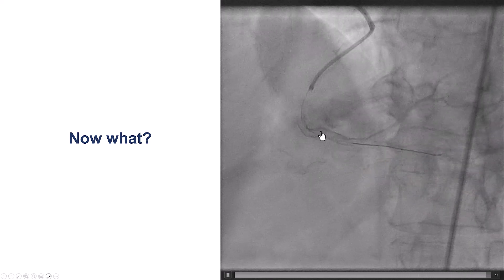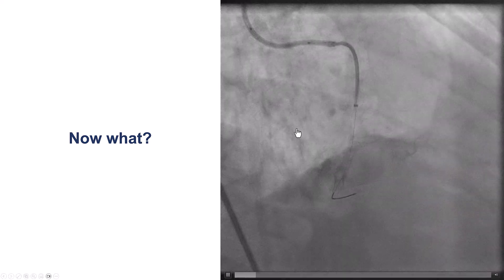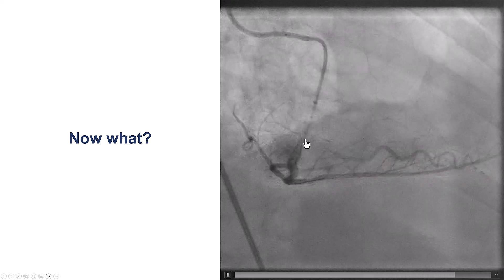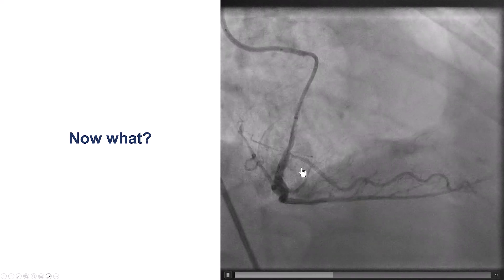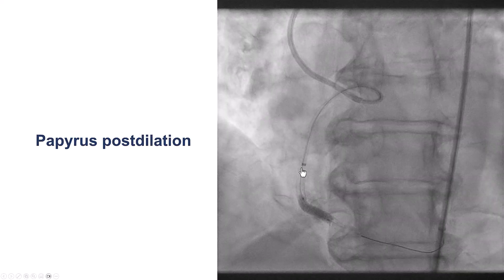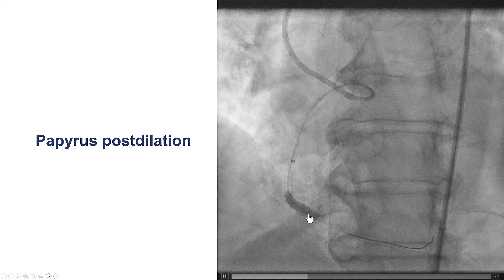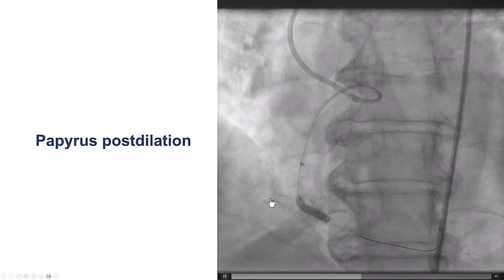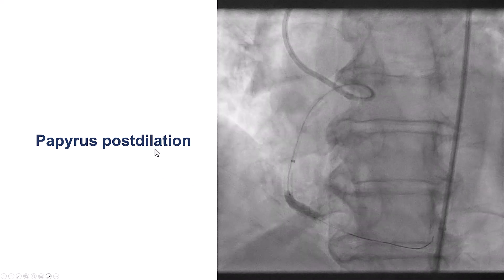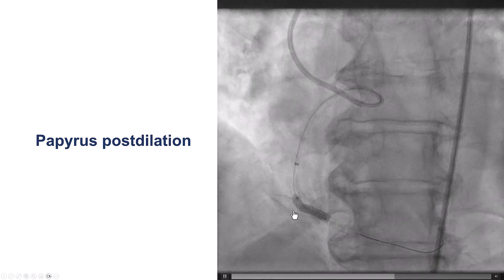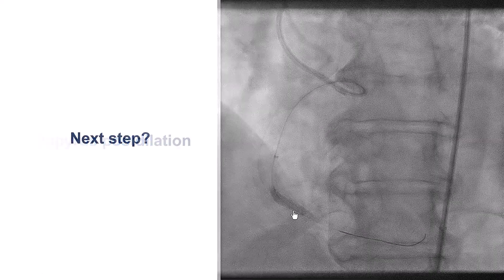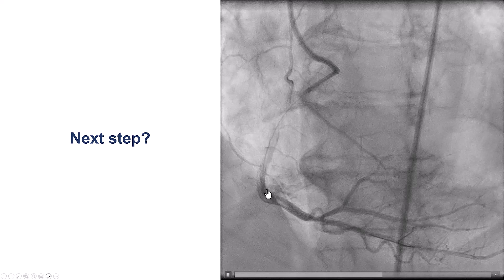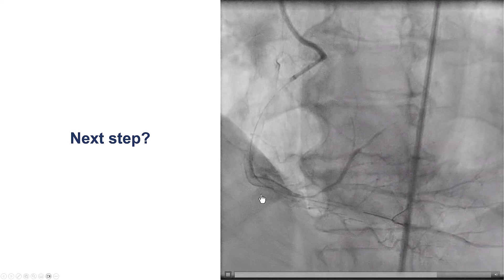We looked at another projection and still had some contrast going outside the vessel wall. Sometimes the Papyrus may not be fully expanded, so we expanded it more using post-dilatation. But once again, we continued to have contrast extravasation.